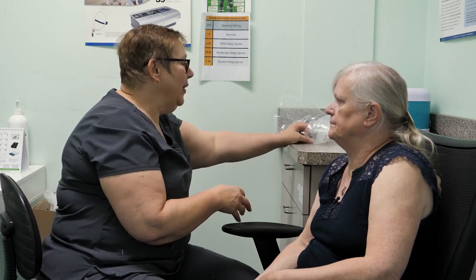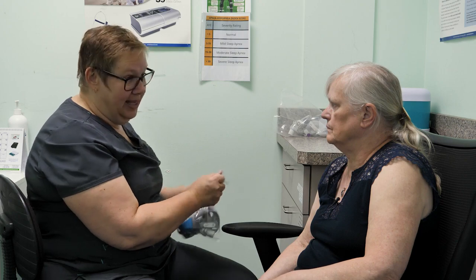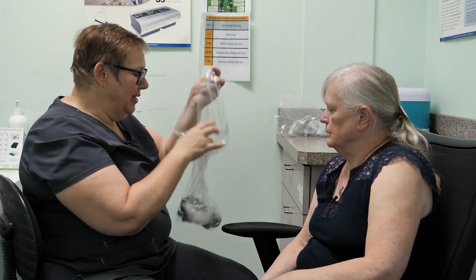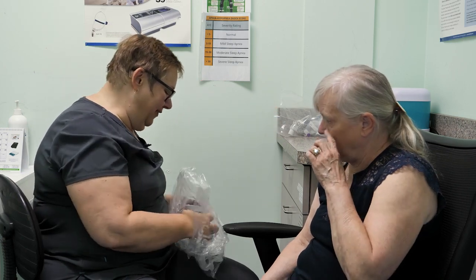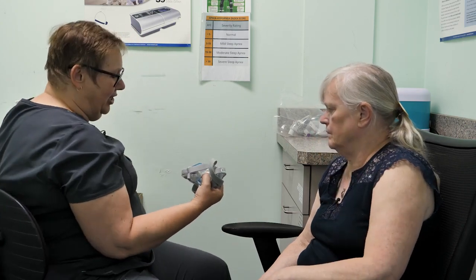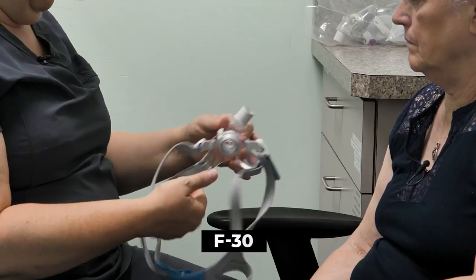Right. So we're going to try with the least invasive one first, and then we're going to see how you feel on that, all right? We can try some different styles if you like until we find the one that you think is going to be the most comfortable during the trial. So these have all been sterilized. They've all gone through our disinfectant system here, and they're packaged up and ready to go. So this one is called an F30.